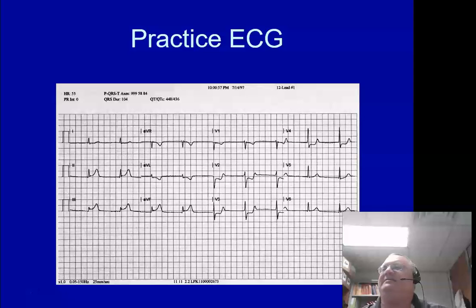These are the ones that are kind of sneaky. The good news is that usually your inferior walls are real quick and easy to point out because it's the boot. Again, I've got massive depression. Good enough to call it a depression. So I've got some major, and I've also got some T-wave flip right here. So again, this guy's having an inferior wall MI.